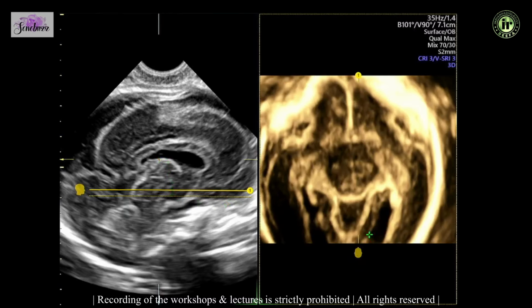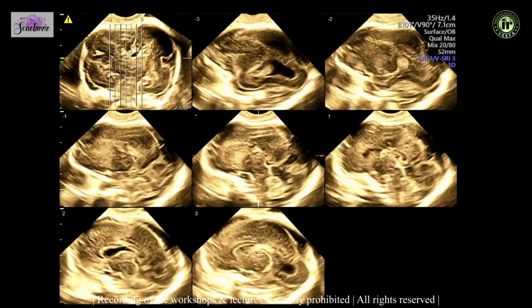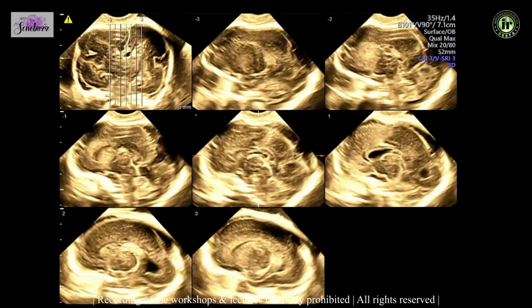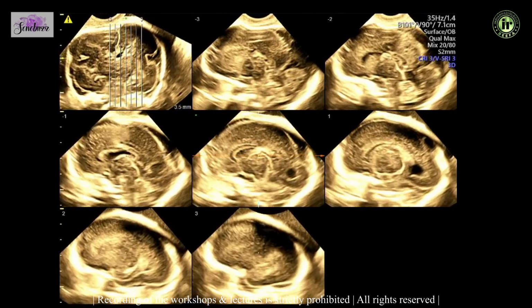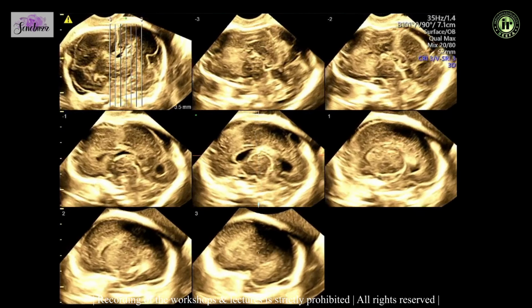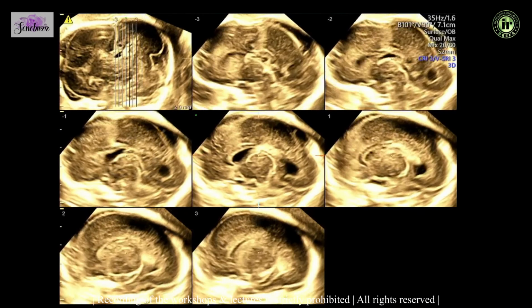So that's the lateral ventricle. You can see that it's at the level of the parieto-occipital sulcus. The other advantage in having the 3D volume is we can do the tomographic imaging. So we can use the central point as the mid-sagittal section here, as you can see here, align it approximately. Take thin slices.